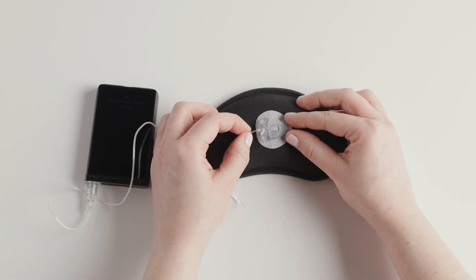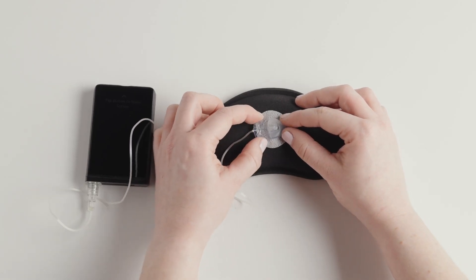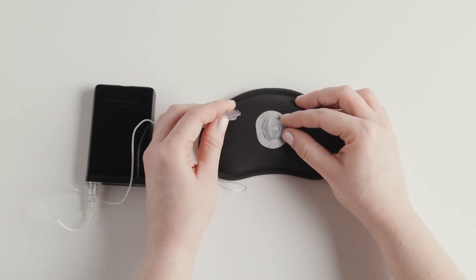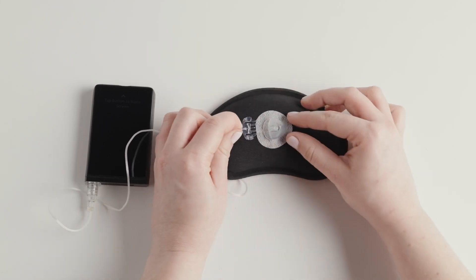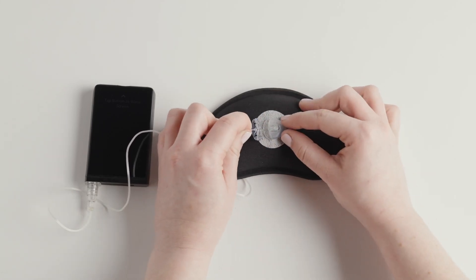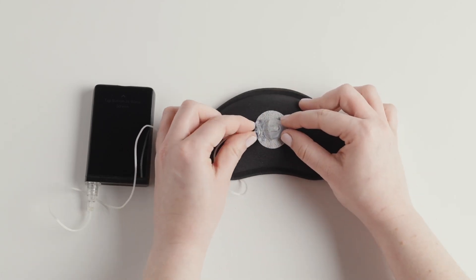The tubing will only connect in one direction, so if it's not going in, flip the end of the tubing over and try again.